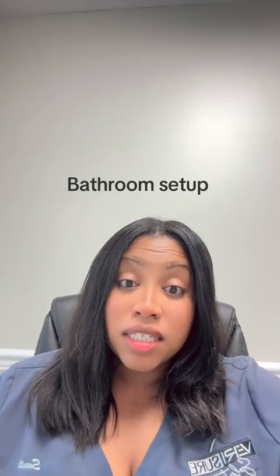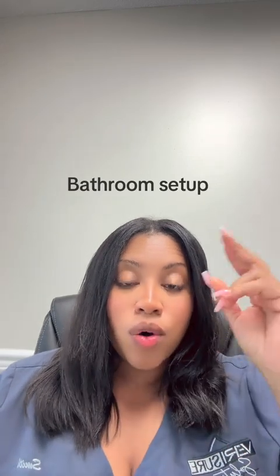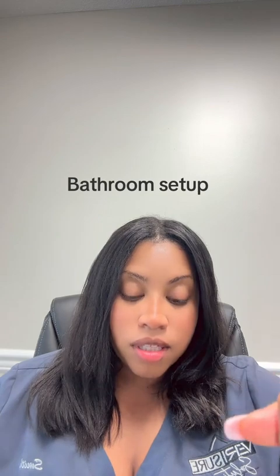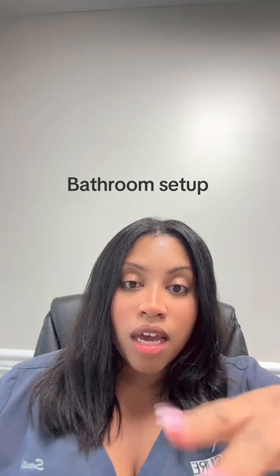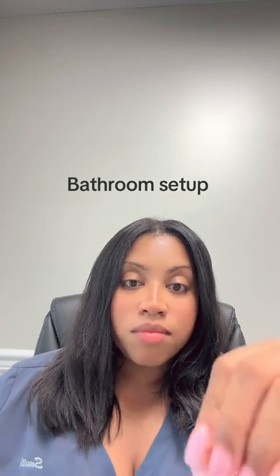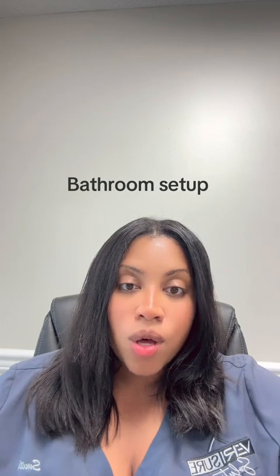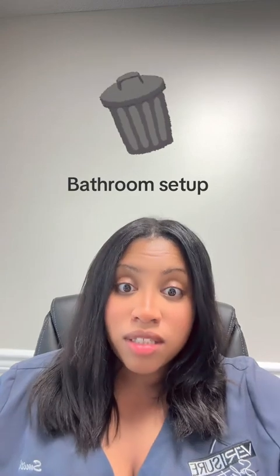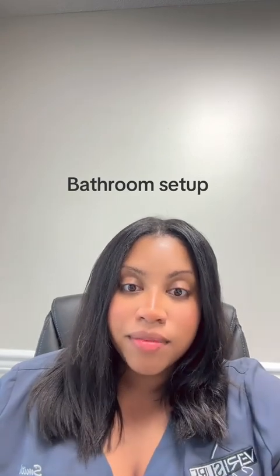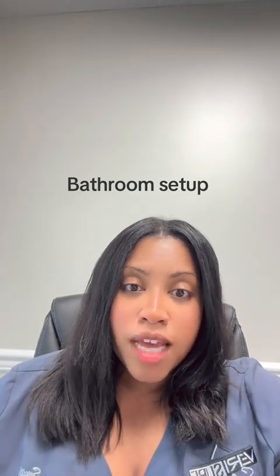And you're also going to set your bathroom up to the DOT standards, which means securing your water source, and securing the top of the toilet down, if there is one, so that they can't adulterate the test. Take anything out that doesn't belong, so any cleaning supplies, any soap, anything but tissue, pretty much take that out, and add your blue tablet to the toilet.